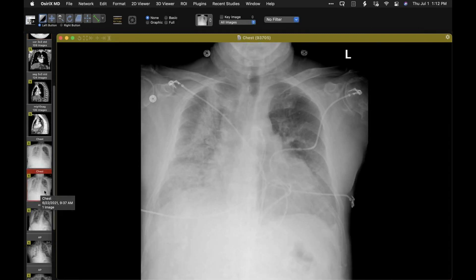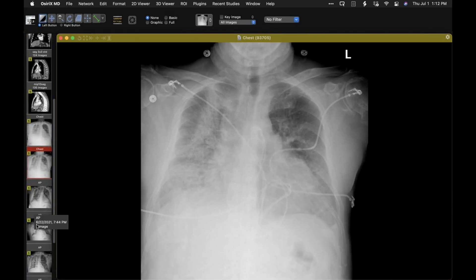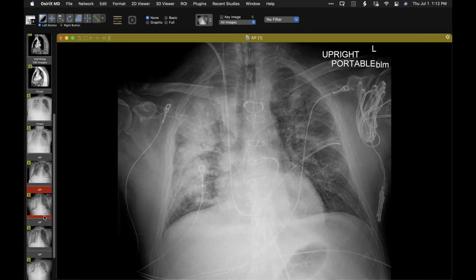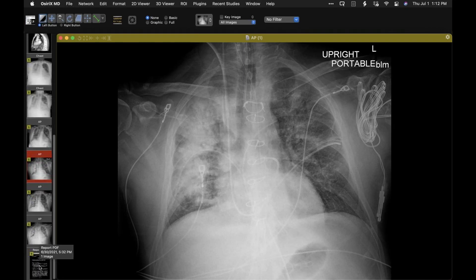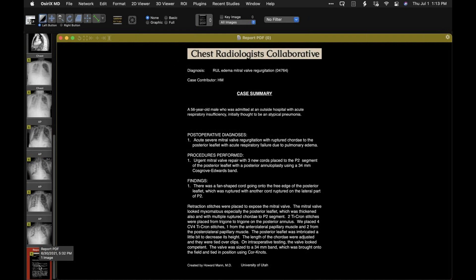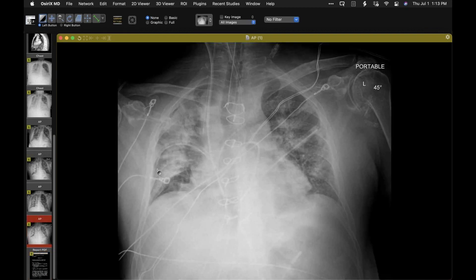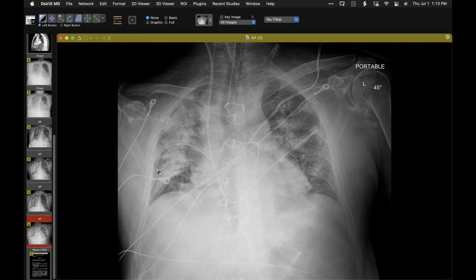I'm going to show you that the asymmetry of the edema and the persistent asymmetry of edema even after surgery. Here is the operative report — they discovered this and diagnosed it on ultrasound but confirmed here: acute severe regurgitation, rupture of chordae to the posterior leaflet, acute respiratory failure. Why the persistent edema even after surgery? If you have acute severe capillary hypertension, you can get the phenomenon called stress failure of the pulmonary capillaries — a form of acute lung injury or at least injury to the pulmonary endothelium.